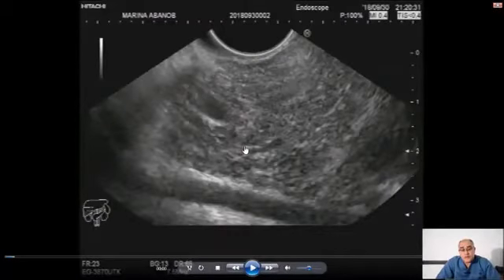We are now scanning from the bulb and postbulbar region, and here we can see the superior mesenteric artery, and here part of the common bile duct, and here part of the pancreatic duct, and here a large part of the pancreatic head. Now in the bulb we can do clockwise and anti-clockwise rotation. When I see the superior mesenteric artery, I can do a little bit clockwise rotation, and then I can see the venous confluence of the portal vein, superior mesenteric vein, and splenic vein.